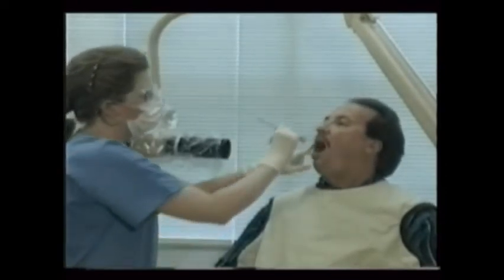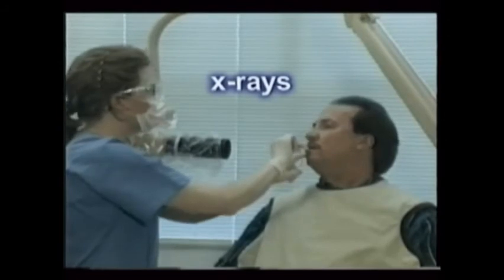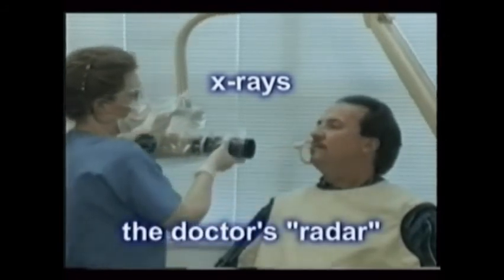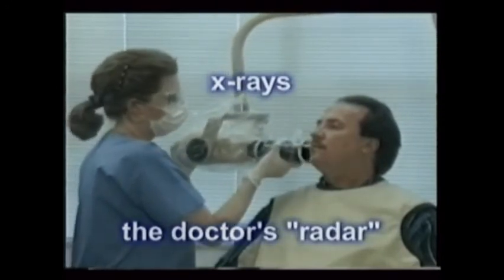One of the most important periodontal diagnostic aids for the dentist are the X-rays. Just as pilots use radar to help them see where they're going when it's cloudy or dark, the dentist uses the X-rays to know what to expect beneath the gums when performing periodontal surgery. A panoral X-ray and a full mouth X-ray series usually take care of most needs.